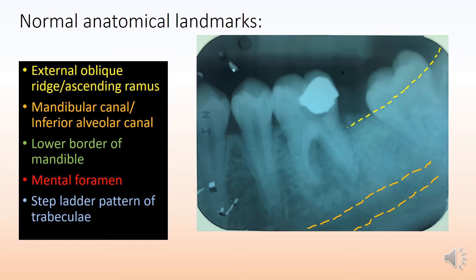The lower border of the mandibular canal — you don't see it always in all radiographs — but depending on the angulation of the way the radiograph was taken, you can see it here indicated by the green line. This is followed by the mental foramen, a faint radiolucency generally seen between the premolar roots, pointed out here by the red dotted line.